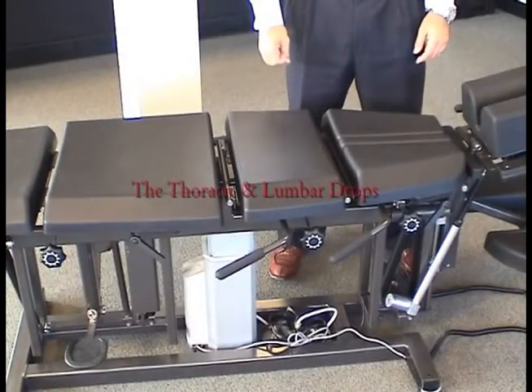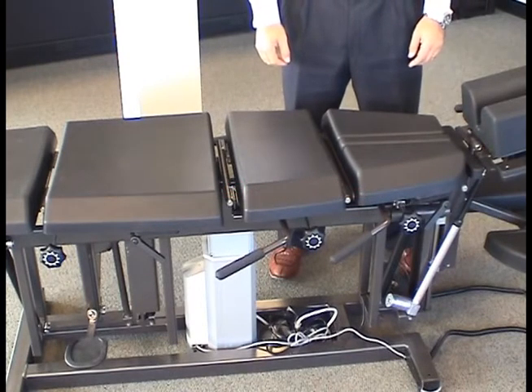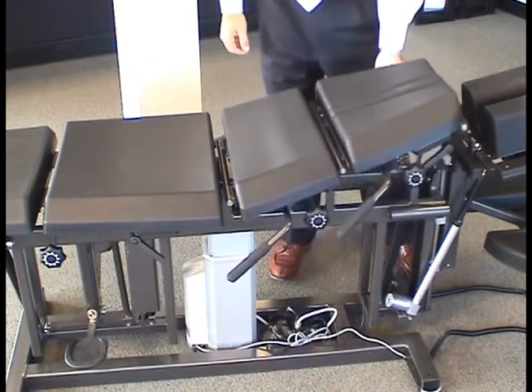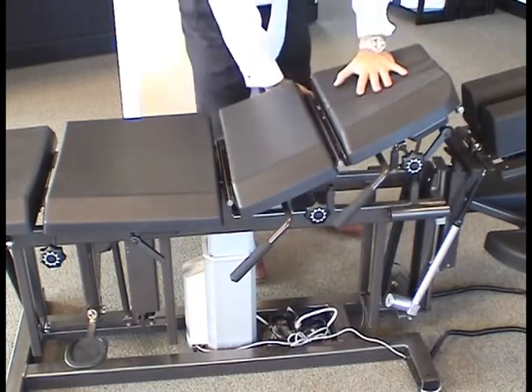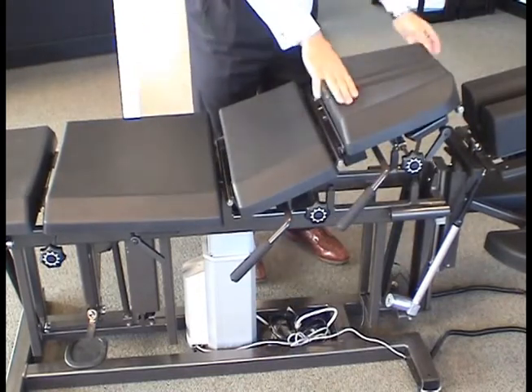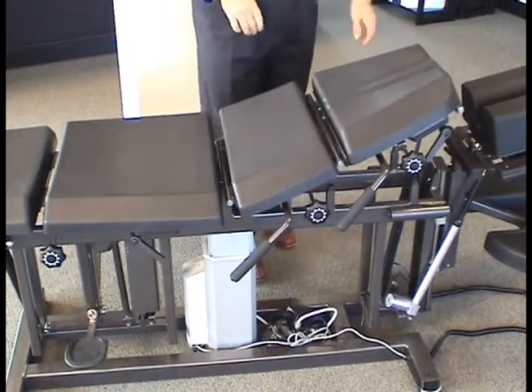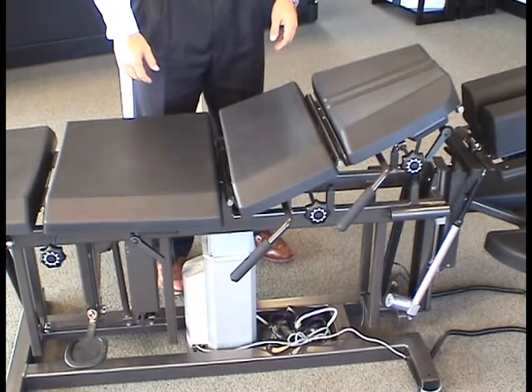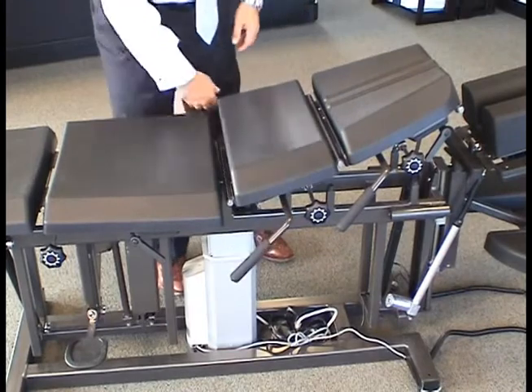Using the thoracic and lumbar pieces. The thoracic and lumbar drops are mounted on a single plate and can be raised to 55 degrees above horizontal. The thoracic drop is a flying drop. This means the thoracic piece can be cocked and dropped at any angle. When your table is equipped with the standard lumbar handle cocking device, the lumbar piece is also a flying drop.